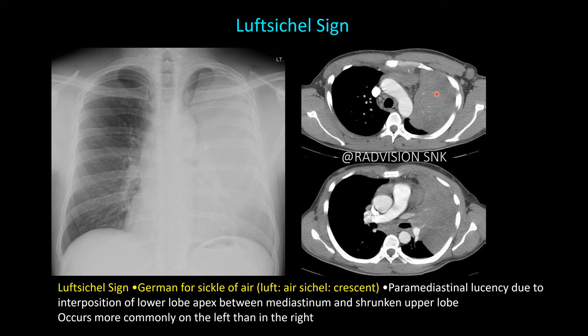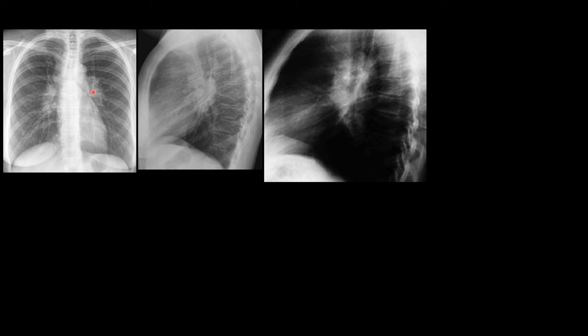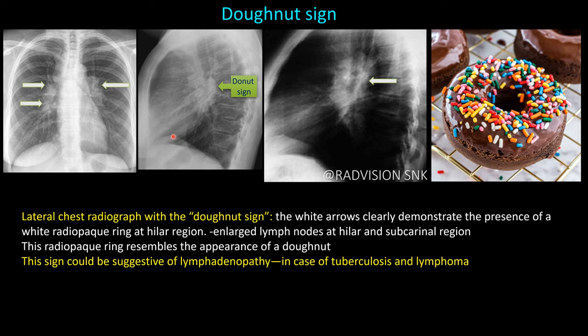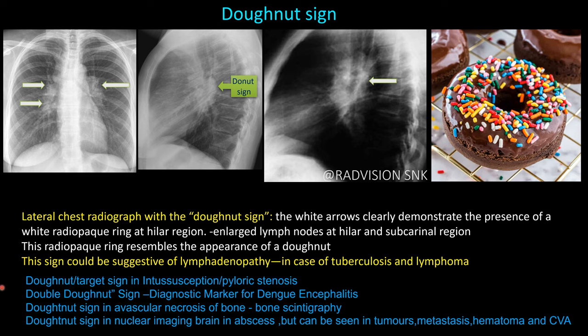Next case: bilateral hilar lymphadenopathy and subcarina lymph nodes are visible. On lateral radiograph, they mimic a radiopaque ring around the lucent bronchus — this is called the doughnut sign. The doughnut sign can be seen on lateral chest radiographs in tuberculosis and lymphoma. Remember also: doughnut sign in other radiology contexts — target sign in intussusception or pyloric stenosis, double doughnut sign in dengue encephalitis, doughnut sign in AVN on bone scintigraphy, and doughnut sign in nuclear brain imaging in abscess, tumors, vascular malformations, metastasis, hematoma, and CVA.